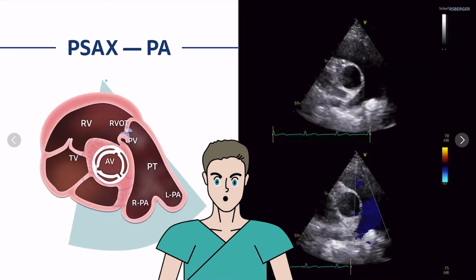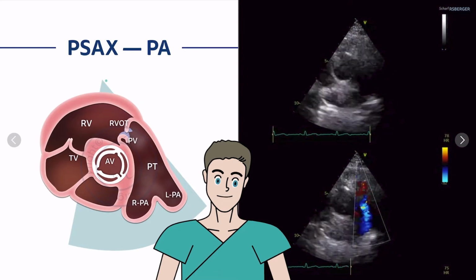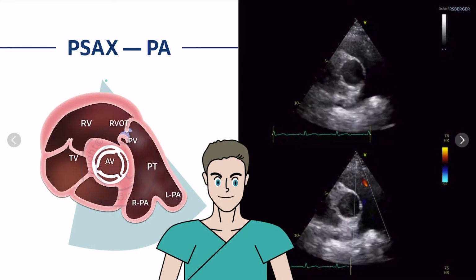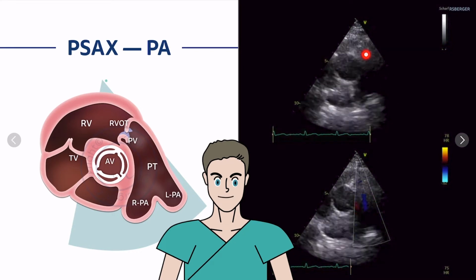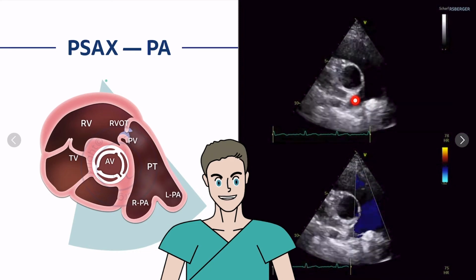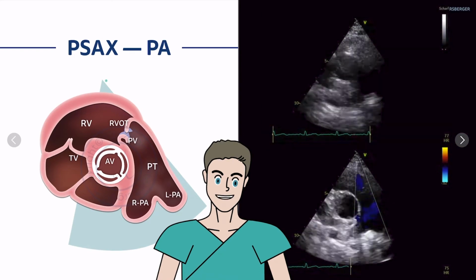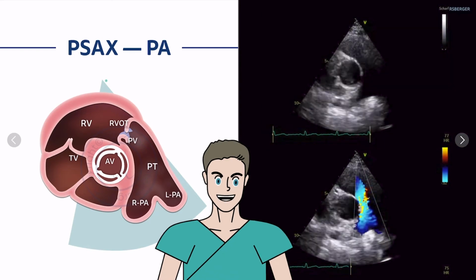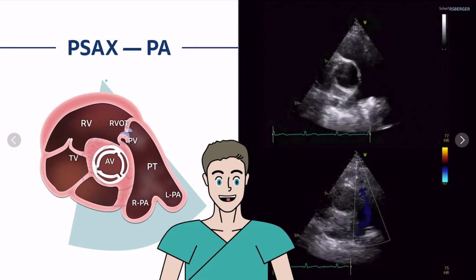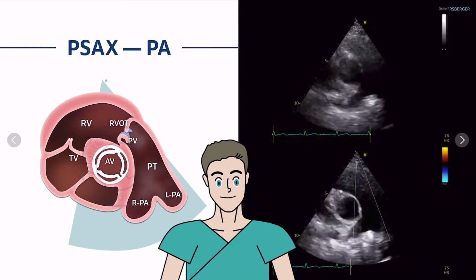In a scan, you can see here the anatomical findings in the B-mode image and the color Doppler findings in this view over here. So we can differentiate here the pulmonic valve, same as here, and this is the pulmonic trunk, and the pulmonic trunk divides into the right pulmonary artery and the left pulmonary artery. Sometimes when you have a large central pulmonary embolism, it's even possible to see the thrombus in this area, depending on where it is located.